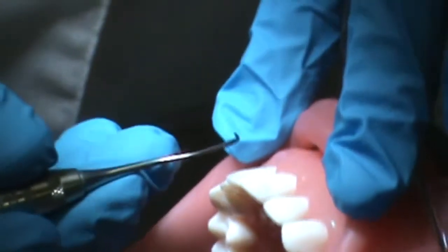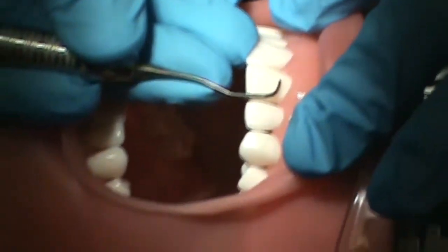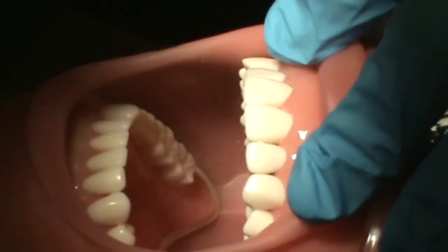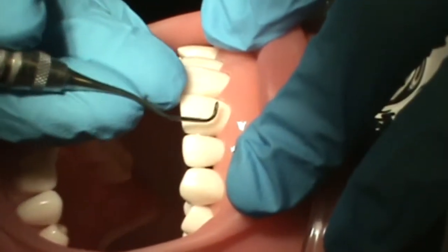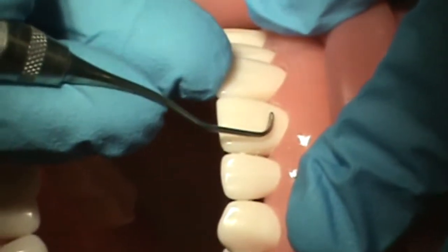She will first select the correct working end to scale the mesial of number 9 by identifying the side of the instrument that tilts towards the tooth surface when placed against the midline of the facial. The incorrect working end would be seen if the face tilts away from the tooth surface when placed against the midline of the facial.